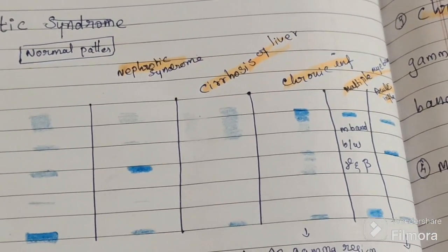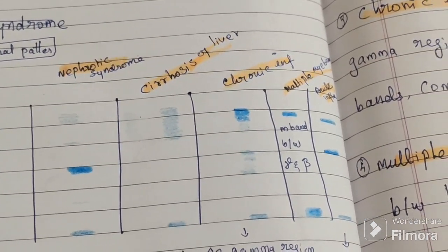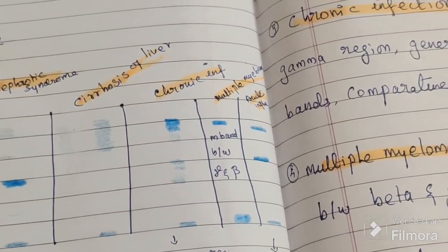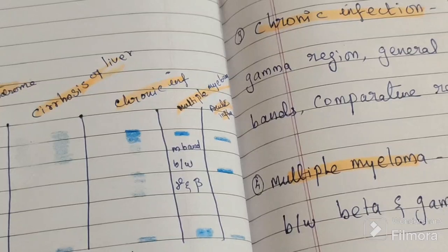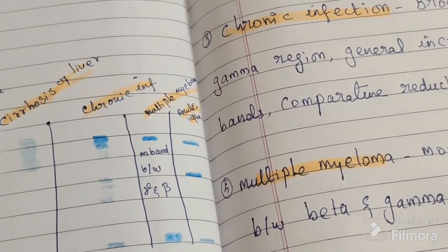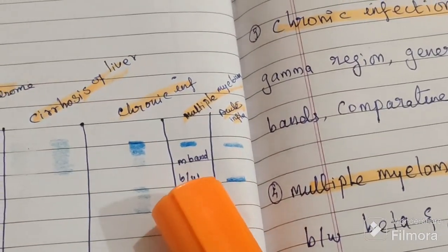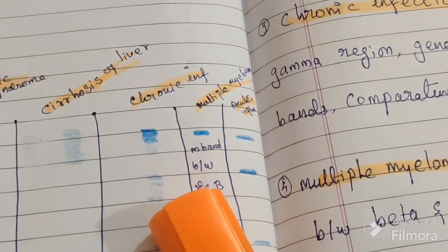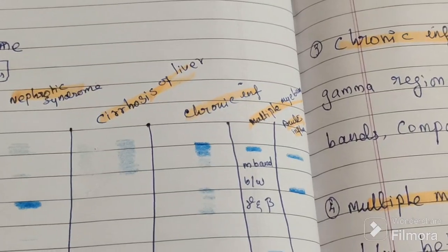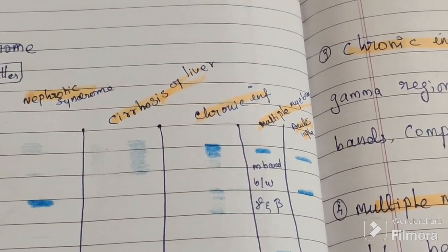Now two patterns are seen here. Here it should be a serum sample. Plasma and serum differ mainly by fibrinogen; plasma is equal to serum plus fibrinogen. In a plasma sample, a particular band is seen because of the fibrinogen, which could be mistaken for an M band. For multiple myeloma, a serum sample is needed.